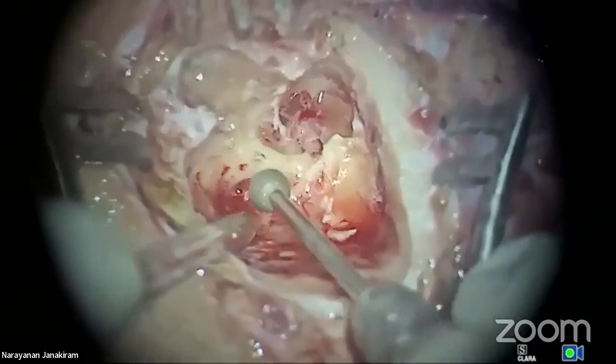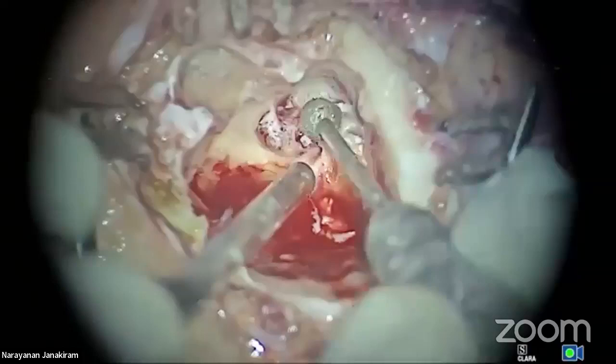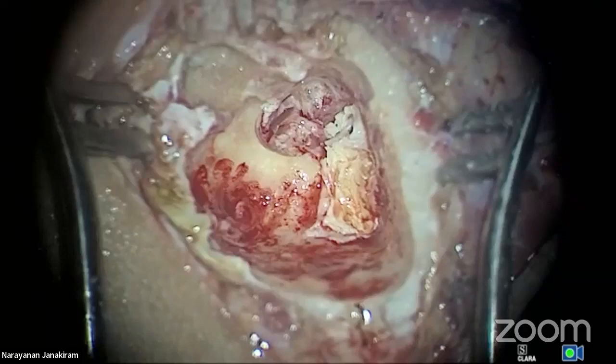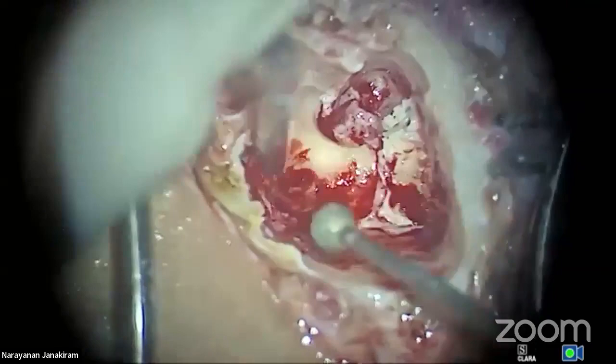Now, having done that, I'm now happy. A little bone is there. The cog is there. I have to remove the cog. Okay. Some more. See, I'm able to see the anterior ligament of malleus. Okay, fine. Now I'm ready for the cholesteatoma. Now give me a cotton ball, good cotton ball. Or give me this. Now what I will do is I'll just try to secure a little hemostasis.